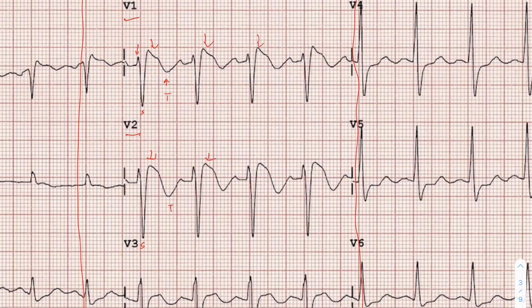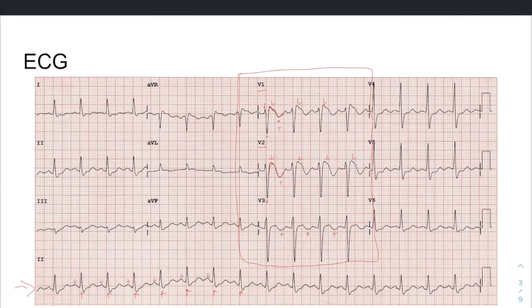It looks like ST elevation. Normally after the S wave you'd hit the J point, have a flat isoelectric period, and then a nice upstroke on the T wave. But here you're seeing really large ST elevation followed by T wave inversion, and the same thing is happening in V1. This mimics the pattern of a STEMI, but that's not actually the case. There is ST elevation in V1 and V2, and T wave inversion also in V3 — and that is part of the answer to this week's ECG.